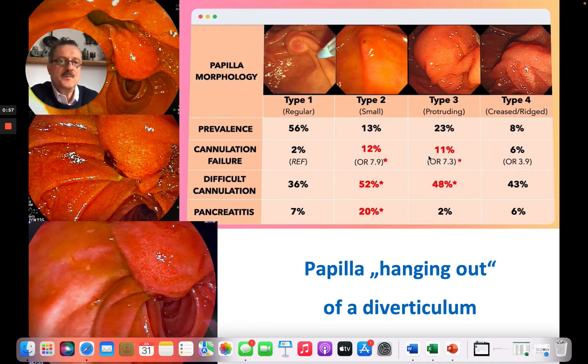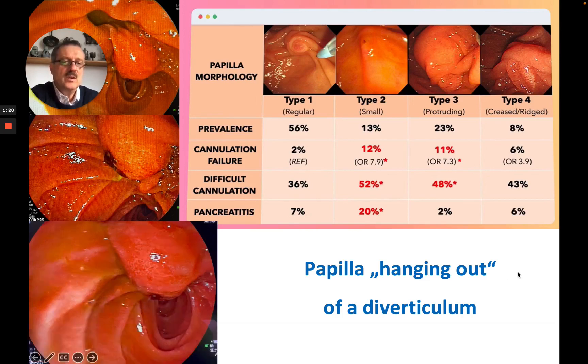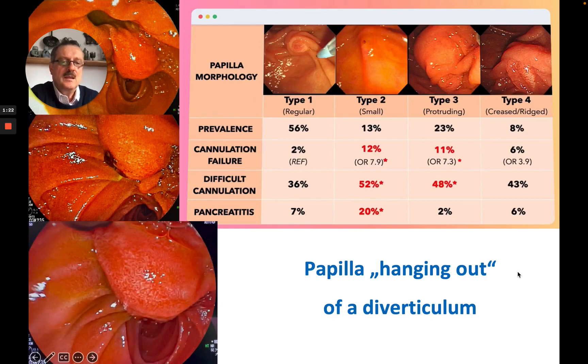So this papilla was a type 3, complicated by the diverticulum, and it was hanging. Cannulation can be difficult because of the floppy consistency, the hanging type, and the orifice being quite distally situated. Starting with the sphincterotome was not our first approach, and we decided to do a needle knife.